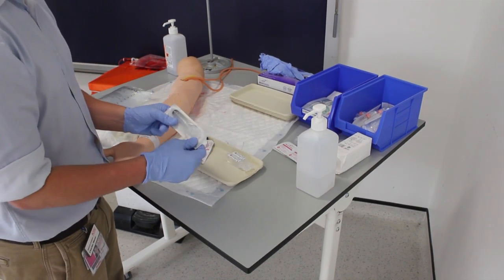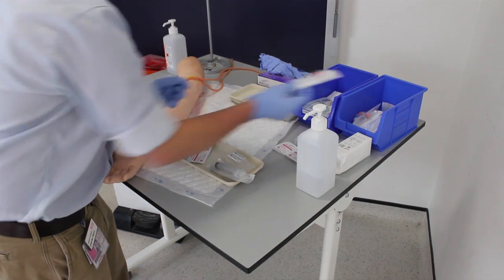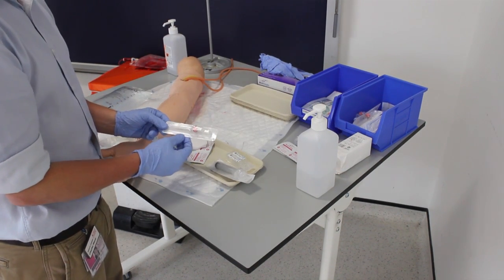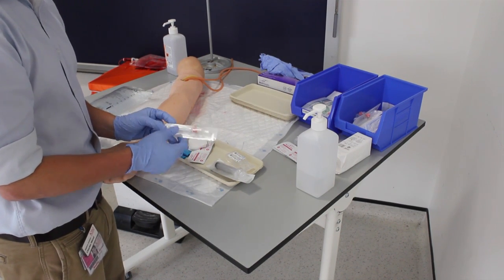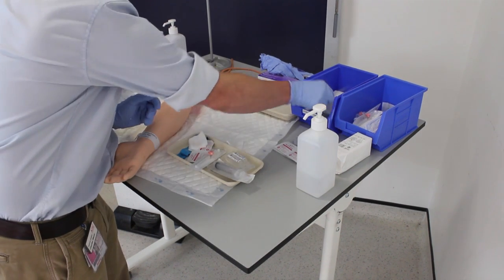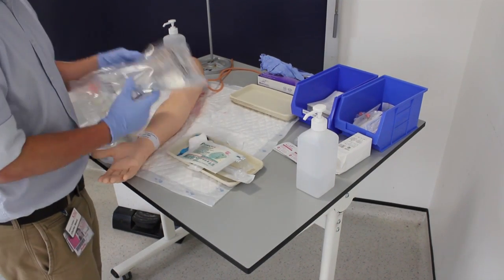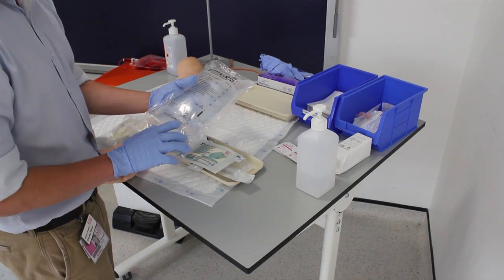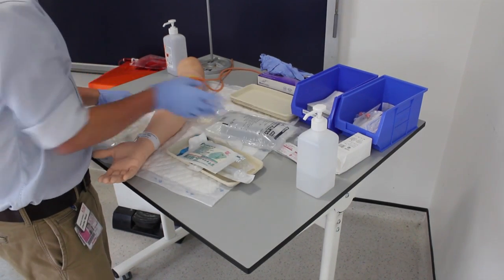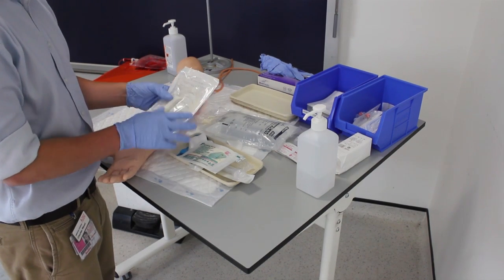I'm going to take a syringe to use as my flush. I'm going to take a cannula — there are different sizes and colors that are good for different things, but in this case we're going to use a pink 20 gauge cannula. Then I'm going to get a tegaderm to stick down the cannula. I'm going to get the appropriate fluids — in this case it's glucose 5% — and again it's important to check the expiry date. I'm going to get a giving set, which is what we use to attach the bag of fluids to the cannula.